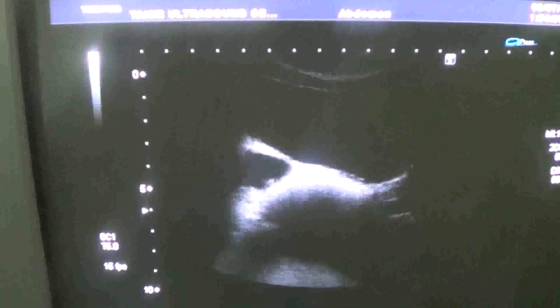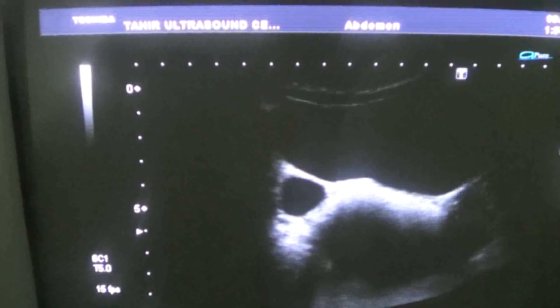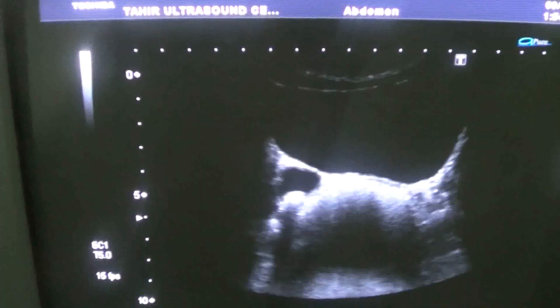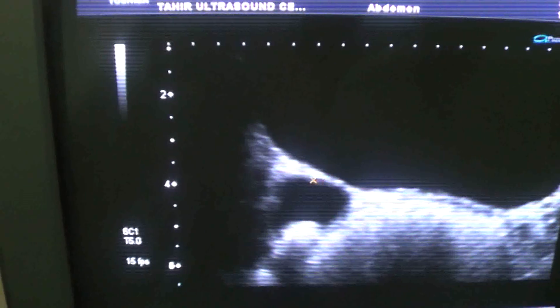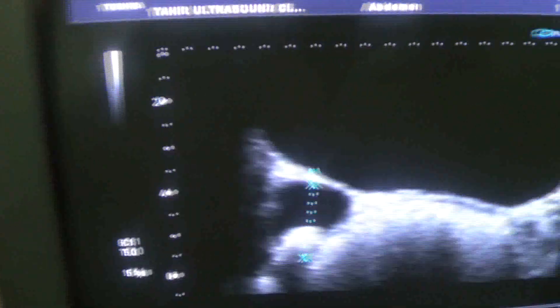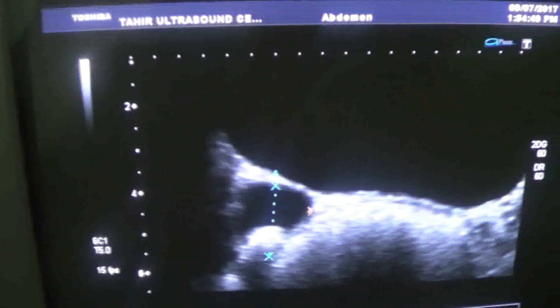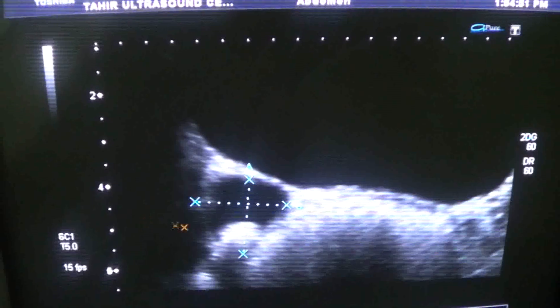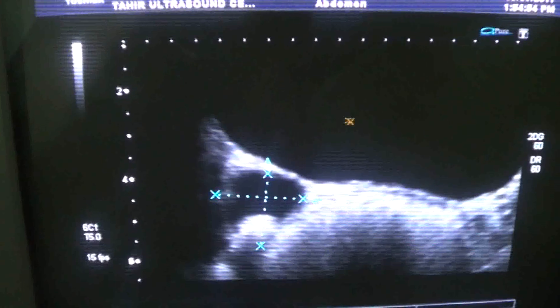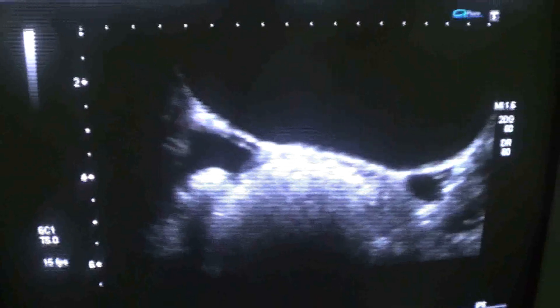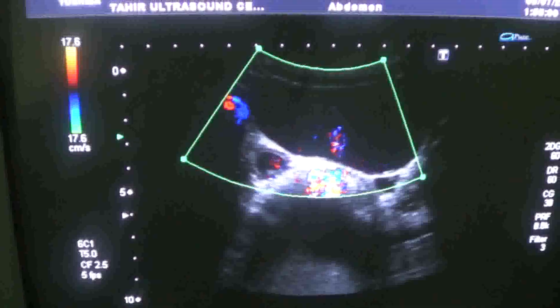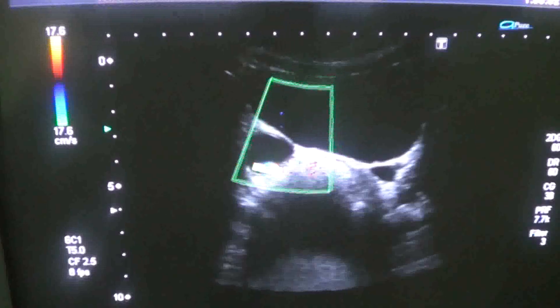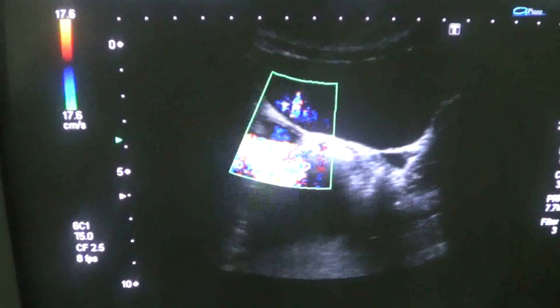Now in transverse section, you can see the dilated distal ureter on the right side, with the calculus within it. This is the urinary bladder. This again gives the twinkling artifact to the ureter.